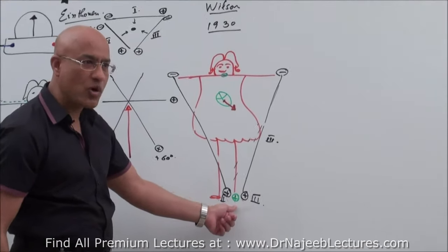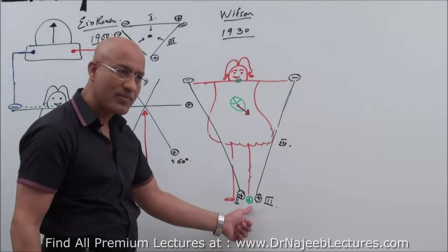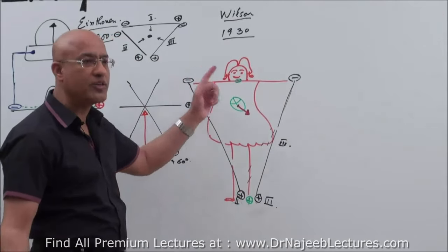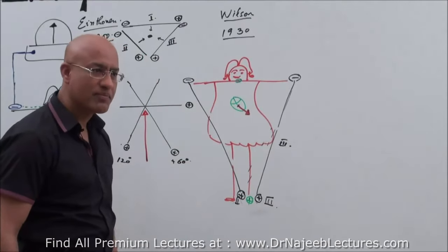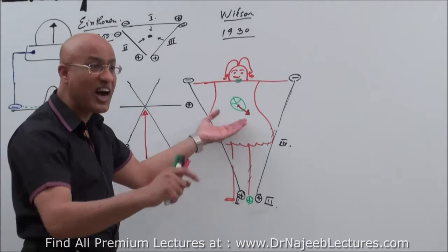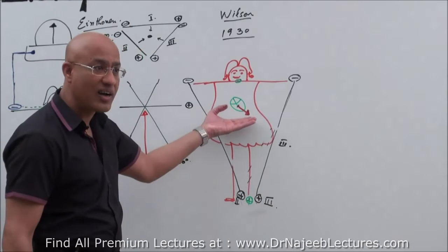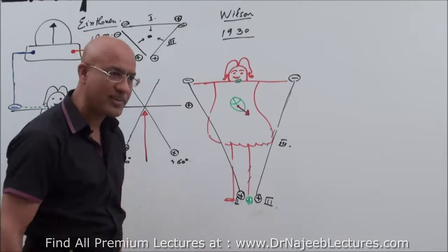You are understanding? He wanted to pick the voltage from where? From the foot. But he didn't want to put negative on right side or left side, because then it will convert in bipolar leads of Einthoven system. He wanted to look straight top. He wanted to look at the bottom of the heart. He wanted to direct this naughty boy's eyes, focus on the bottom of the heart, so that electrical activity of the heart can be also judged or viewed from this point.